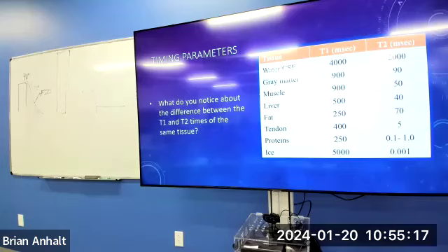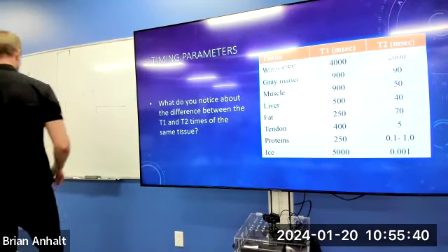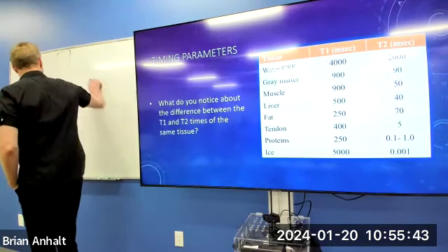It's helping radiologists. What the AI can do at this point, and it's not MRI yet, is quantify and do measurements. For lung scans, out of hundreds of images, it'll say to the radiologist, look at these 10 right now. So my question is, have you ever seen these wordings where it says unknown in PACS or McKesson?